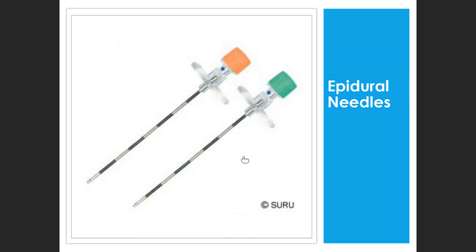These are epidural needles. Epidural needles are placed in the epidural space, just above the dura, meaning not in the subarachnoid space. So the end point for them is what we call loss of resistance, and you'll do a bit of that with, I think it's Dr. Harvey, on Friday. Notice that these are graduated. They are marked in centimeters: 1, 2, 3, 4, 5, 6, 7, 8 centimeters.